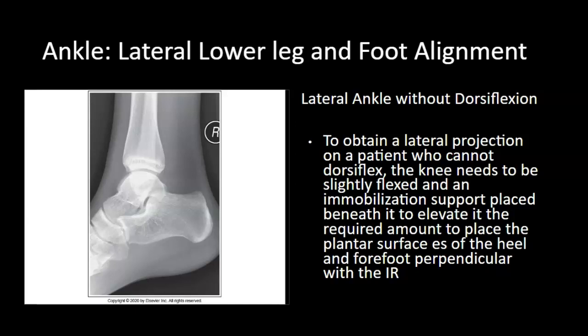However, if the patient is just stating they cannot dorsiflex, please, I highly encourage you to help support them and comfort them so that you can really obtain the appropriate imaging.